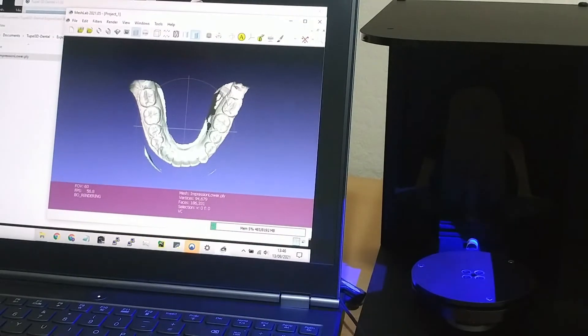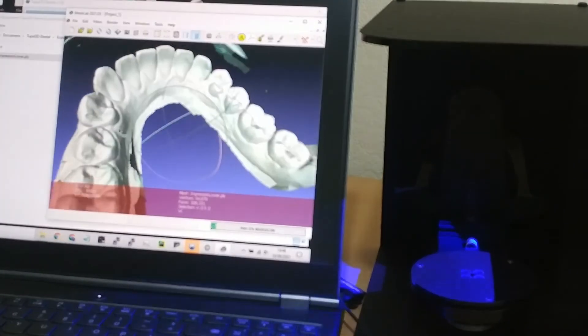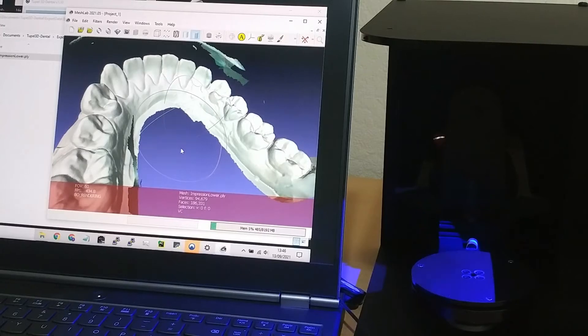And there it is. It's come out pretty well, so in this case no stone model was required.